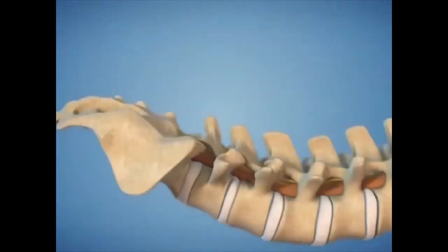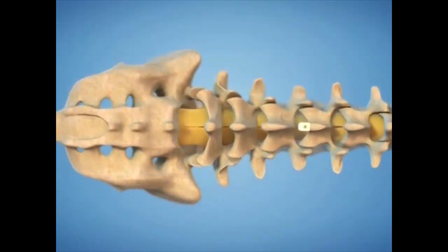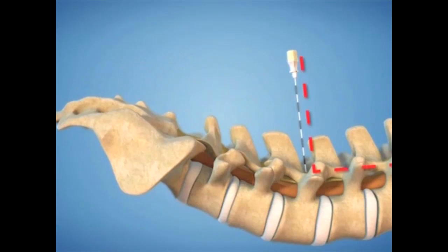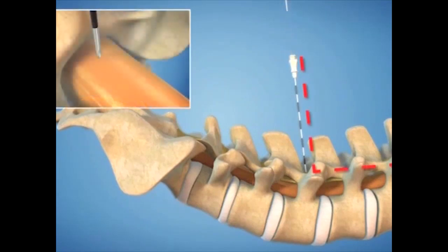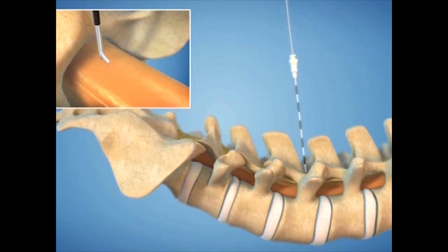The needle passes between the spinous processes with the needle nearly perpendicular to the spinal canal. Because of the needle angle, the catheter must take a sharp bend as it exits the needle into the intrathecal space. This sharp bend can make advancement of the catheter difficult, and in some cases requires the implanting physician to make repeated needle punctures to advance the catheter. This creates multiple dural holes, increasing the likelihood of cerebrospinal fluid leakage.